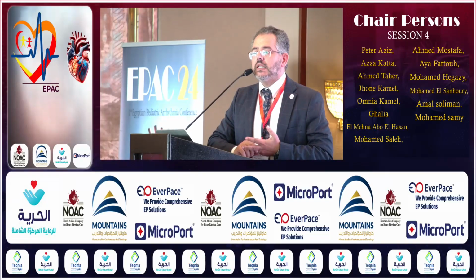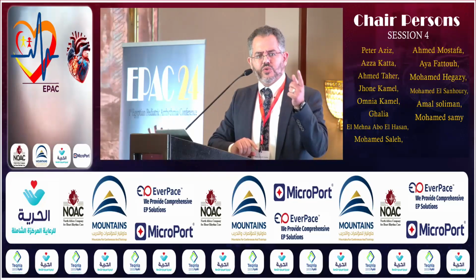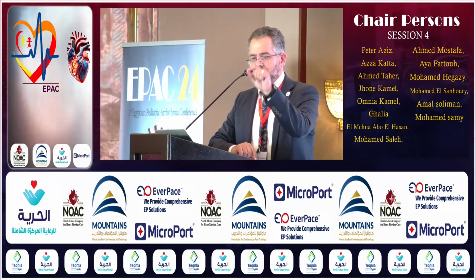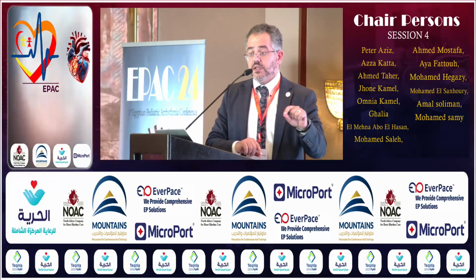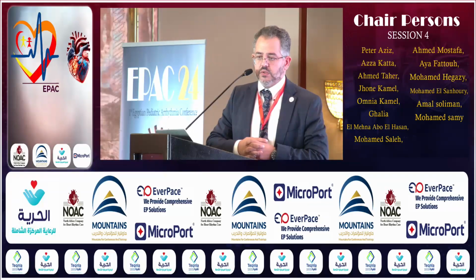And yes, there are still conditions where the patient himself, I was just discussing with Dr. Husseini today a patient who read about cryoablation and specifically requested to be treated with cryoablation for fear of any complications related to the AV node. So yes, there will be conditions where you offer cryoablation.